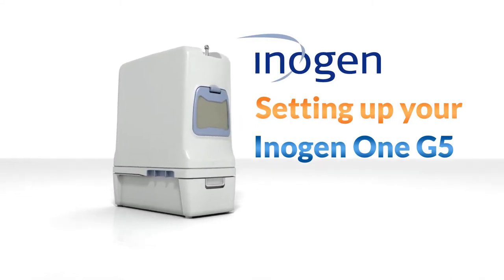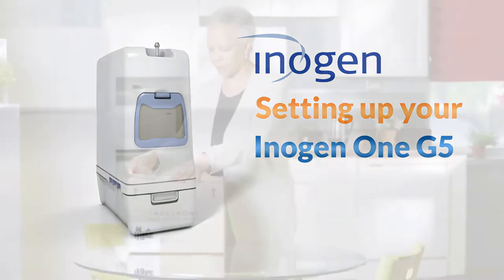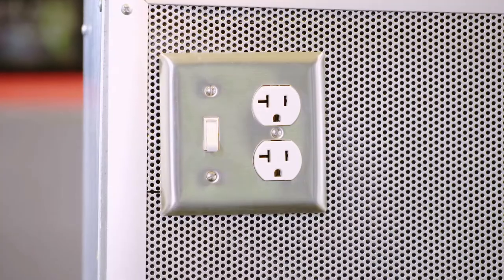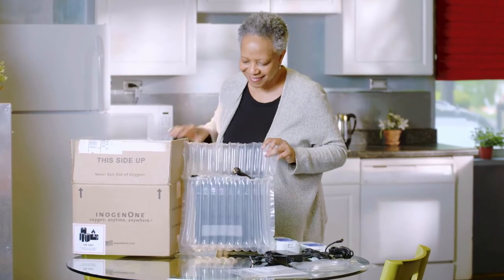Hello and thank you for choosing the Inogen 1 G5. This short video will help you set up your new Inogen 1 G5. When setting it up for the first time, you will want to set the system up on a table near an electrical outlet. If you have not yet unpacked your boxes, you may want to pause this video and do so now.